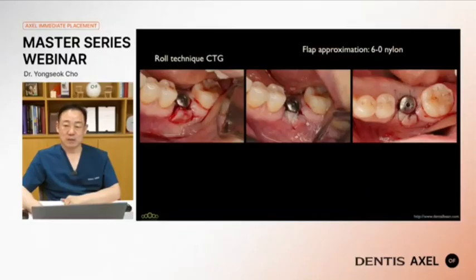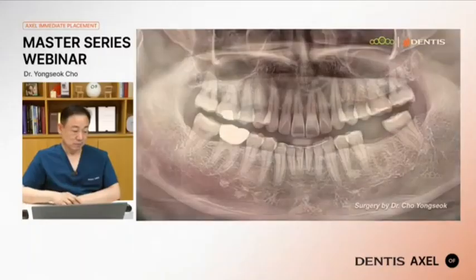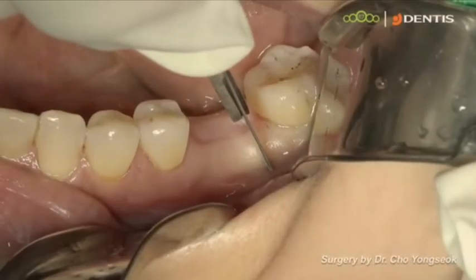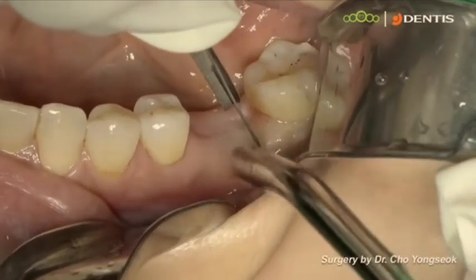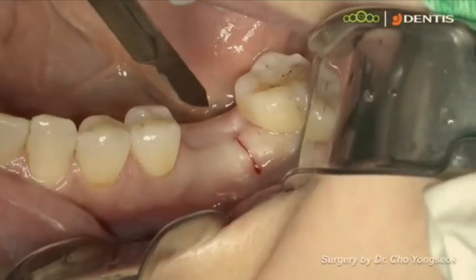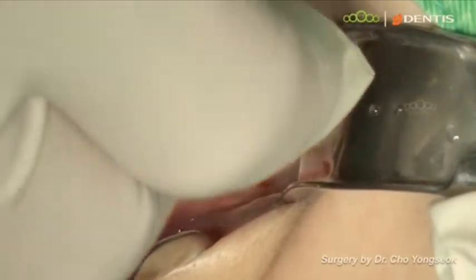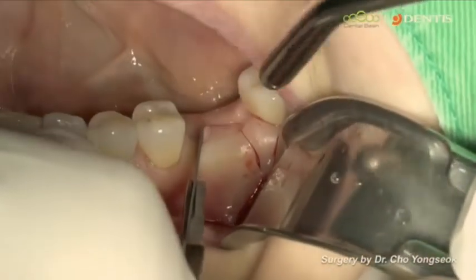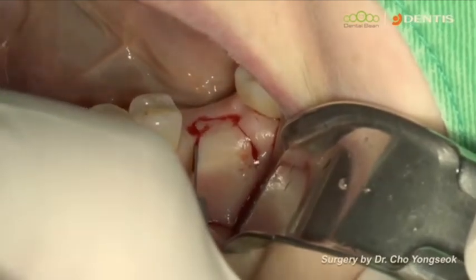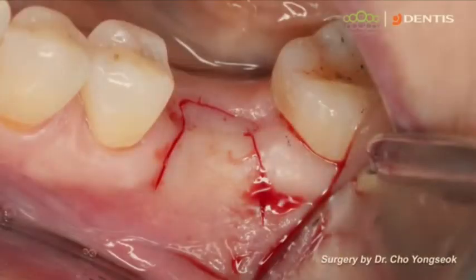Okay, here to do the roll technique, I made the incision design like this.